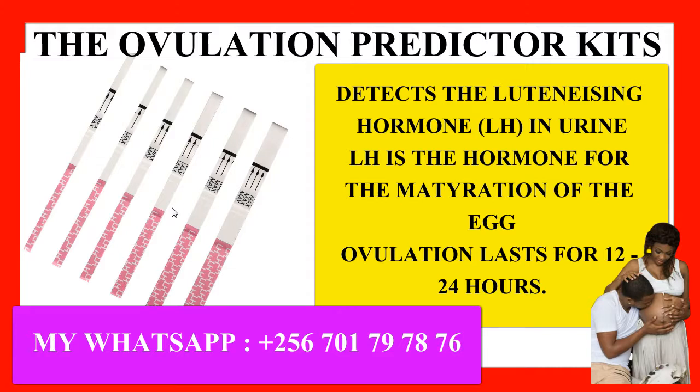So you can begin charting 5 days before, and normally there are 2 lines on the predictor kits. There's the test line and then there's the control line. The test line specifically tends to darken. It becomes darker when the LH, or when your ovulation day, is reaching. So when it is darkest, then it means your ovulation period has reached. So the ovulation predictor kits, much as they need lots of attention when you're interpreting them, can give you a clue of when your ovulation day is about to reach.